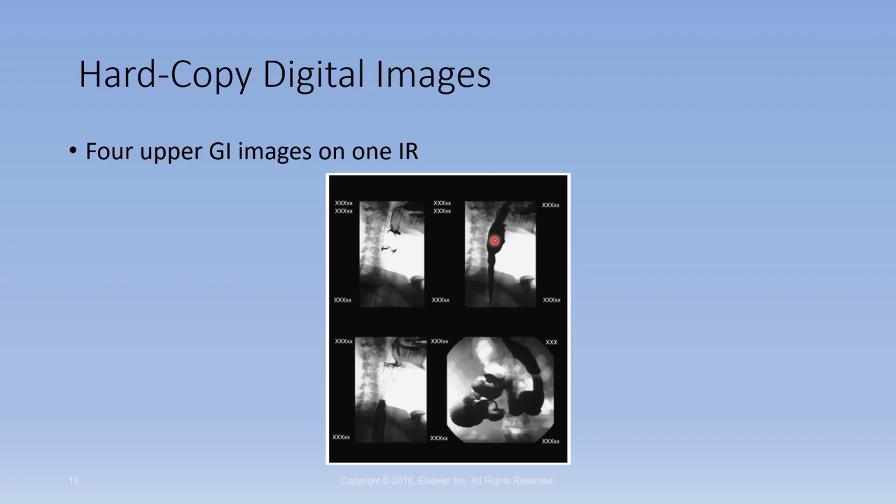Look at the bone in comparison to the barium. All of this would represent air, which normally that would be black, and it's not, because fluoroscopy is actually a positive. So everything white would become black, and everything black would become white. Why? Because fluoro is an opposite of your still image. So that was the point trying to be made with these particular images. They are on page 476, figure 12.55. So everything is opposite when you're looking at fluoro.